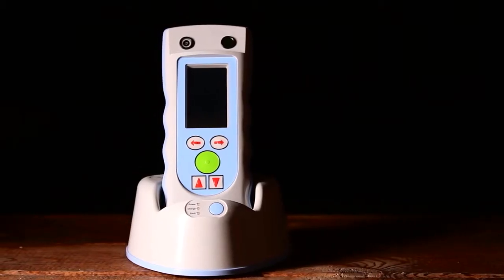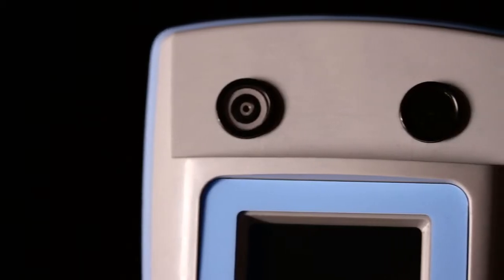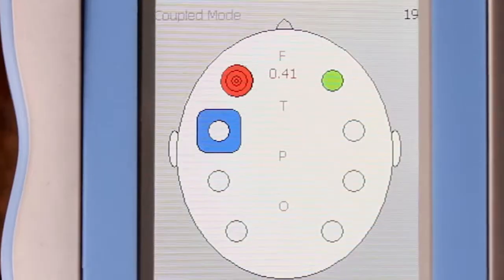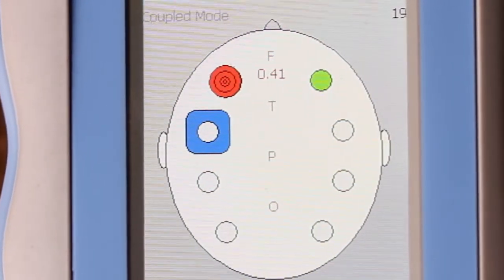The InfraScanner is a handheld, lightweight system that uses a disposable fiber optic shield for patient interface. It uses near-infrared technology to detect intracranial bleeding. It can detect a hematoma of 3.5 cc's in volume at a distance of 3.5 centimeters from the scalp surface.